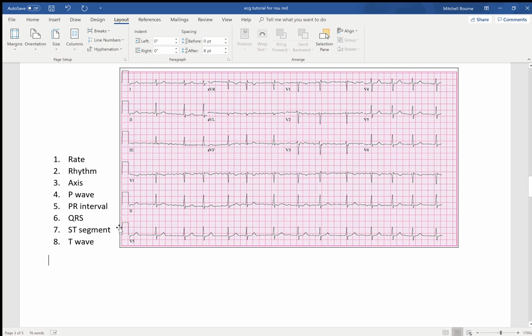If you felt this patient's pulse, you would feel boom, boom, boom, boom, boom. It would be all over the place, not necessarily fast or slow, but irregular. So this is irregularly irregular. Regularly irregular would be where it's irregular, but there's a pattern to it. There's a thing called bigeminy, where if you're feeling the patient's pulse, it's boop, boop, pause, boom, boom, pause. I'm not talking about heart sounds, I'm talking about the actual pulse. There are pauses in it, but there's a pattern to it. That's regularly irregular. Here, there is no pattern to it.